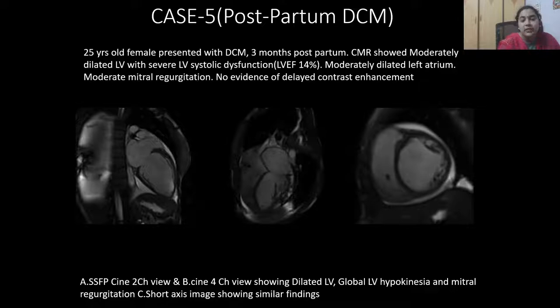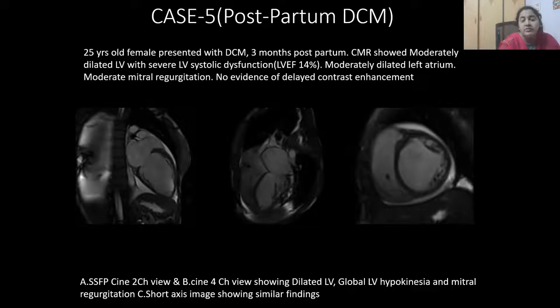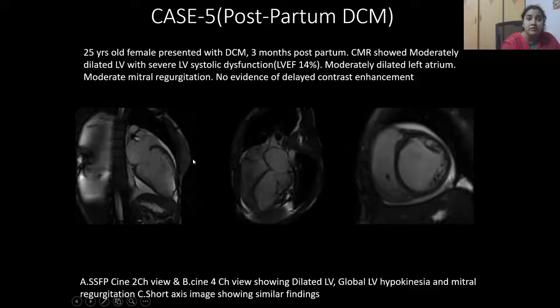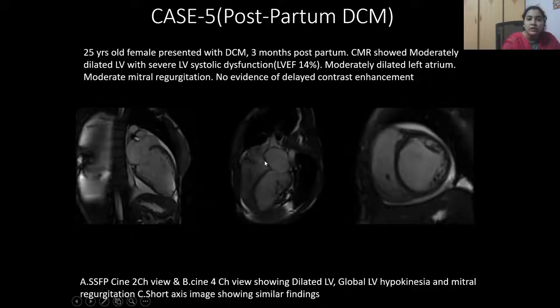Case 5 — Postpartum DCM: a 25-year-old female presented with dilated cardiomyopathy three months postpartum. Cardiac MRI showed moderately dilated left ventricle with severe LV systolic dysfunction and ejection fraction of approximately 14%, moderately dilated left atrium, mild-to-moderate mitral regurgitation, and no evidence of delayed contrast enhancement. SSFP two-chamber and four-chamber views show dilated left ventricle, global LV hypokinesia, and mitral regurgitation. Short-axis imaging showed similar findings.